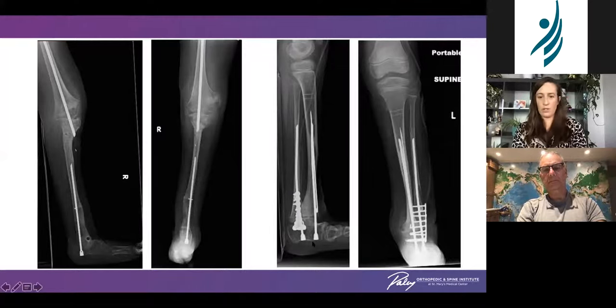Going retrograde in the foot — this is a nice example where you can see that the head is able to be screwed right up into the bone so that there's no prominence, which allows this patient to weight-bear quite comfortably.